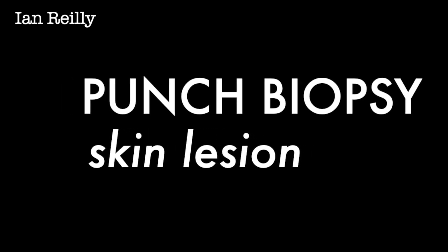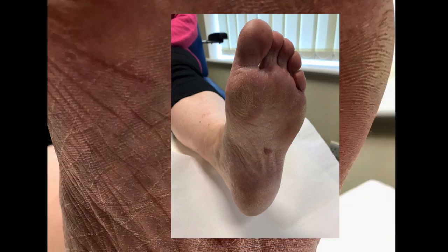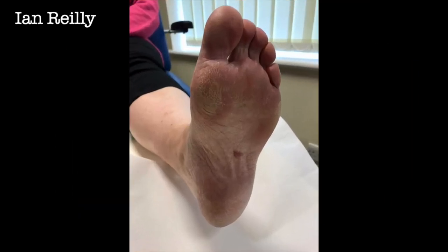Quick video this week on punch biopsy for a skin lesion. This patient had a plantar lesion on the foot for very many years and recently it had changed in size and diameter. So I'm therefore duty bound to do some form of testing to make sure that it's nothing malignant or anything cheeky. So we do a small punch biopsy.